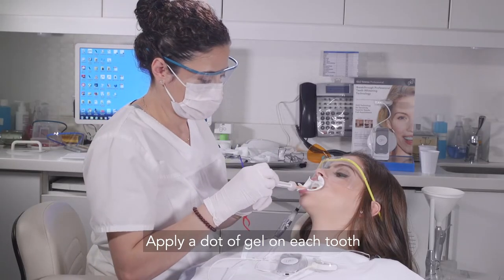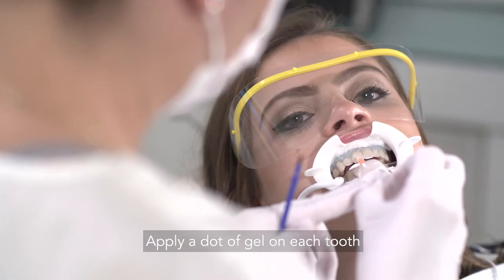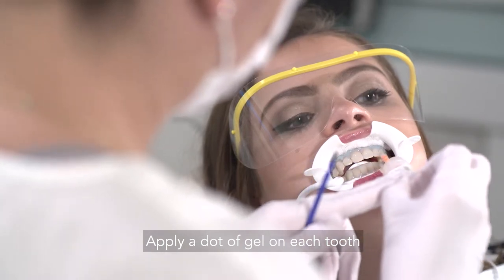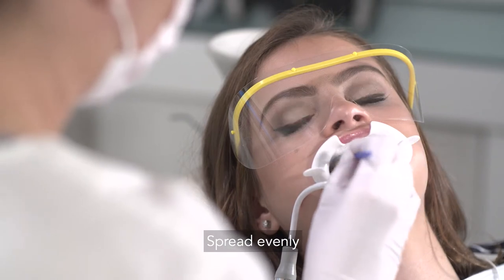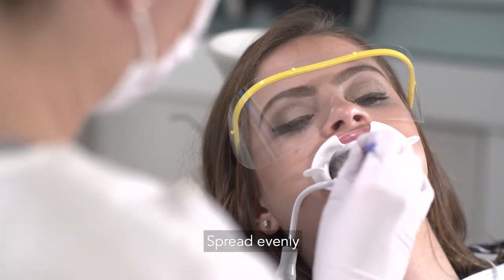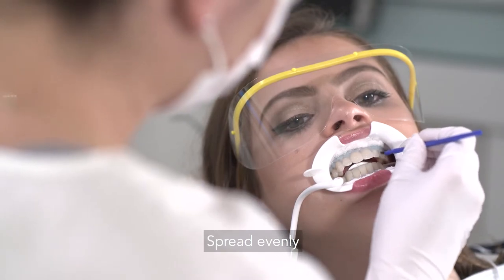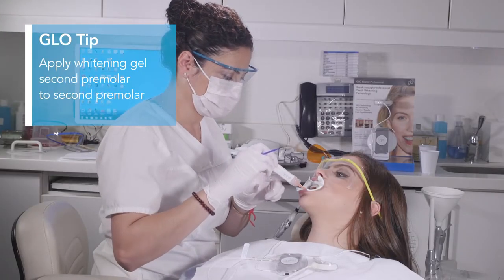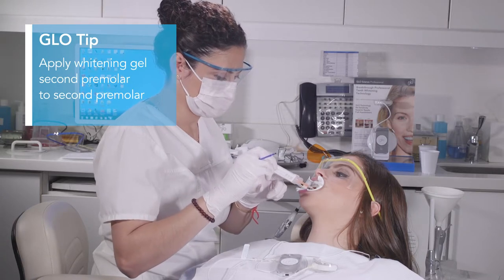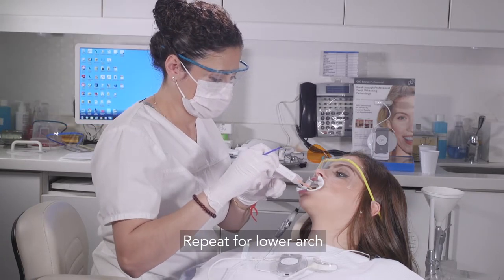On the upper arch, apply a small dot of gel to the facial aspect of the enamel surfaces. Use a bender brush or micro brush to spread an even layer of whitening gel on the enamel surface and into the interdental space where the stain likes to hide. Glow whitens both top and bottom teeth at the same time, so repeat the gel application for the lower arch.